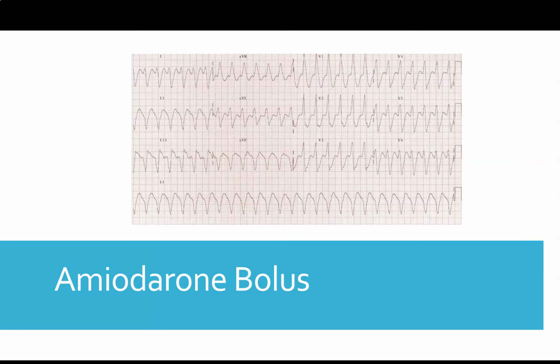All right, so let's look at another scenario in general mode again. We're going to pretend that we have a patient who presents in ventricular tachycardia, but they are stable. You make the decision that you're going to manage this patient with amiodarone. You're going to give this patient a 150 of amio. And the question I'm going to ask you is, if this patient is in ventricular tachycardia, you are giving them amiodarone to get them out of ventricular tachycardia, are you giving the patient a bolus or an infusion of amiodarone? I hope everybody said a bolus of amiodarone.